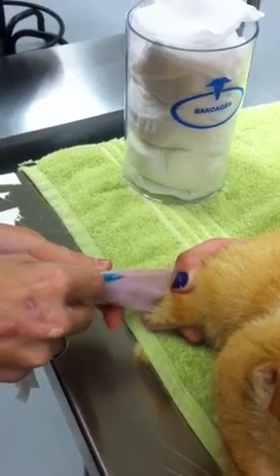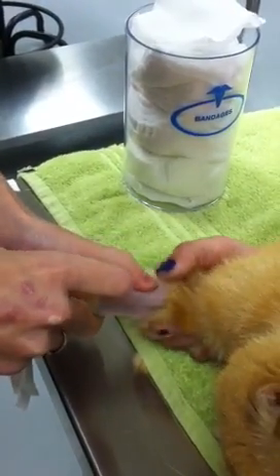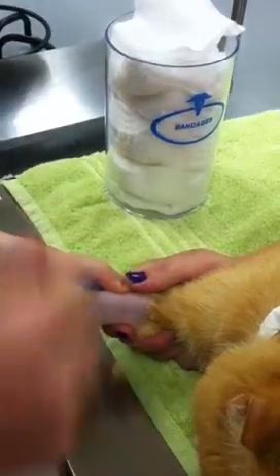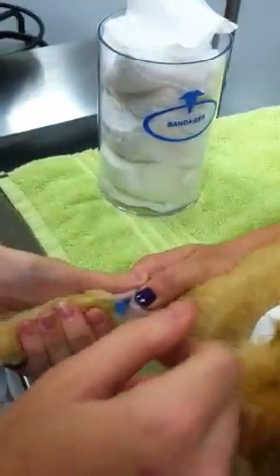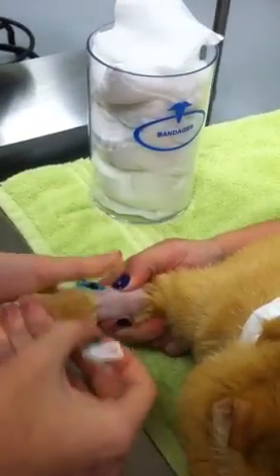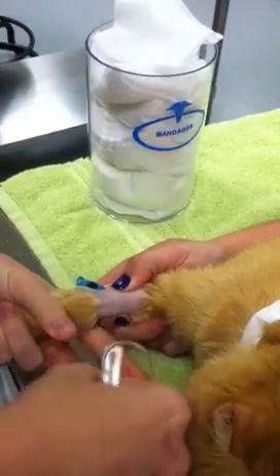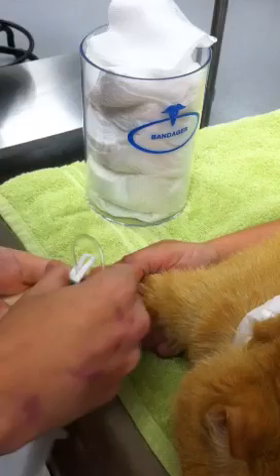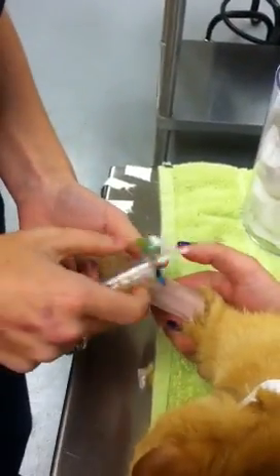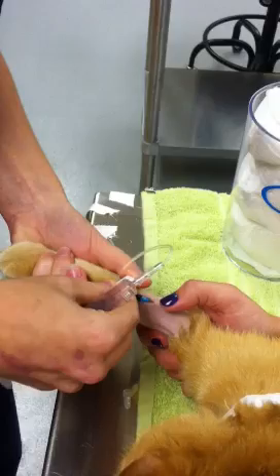I'm going to slide the catheter in now. Heather is going to release and hold on to this for me so that I can put our T-port on, which has been prepped with saline. Once I have that on, I will make sure that this is unclamped.